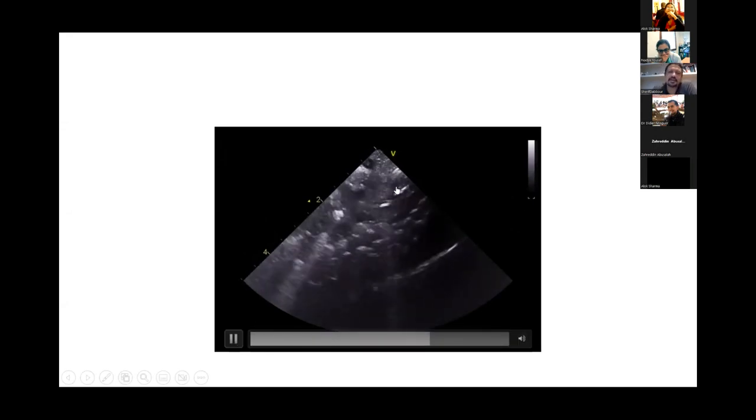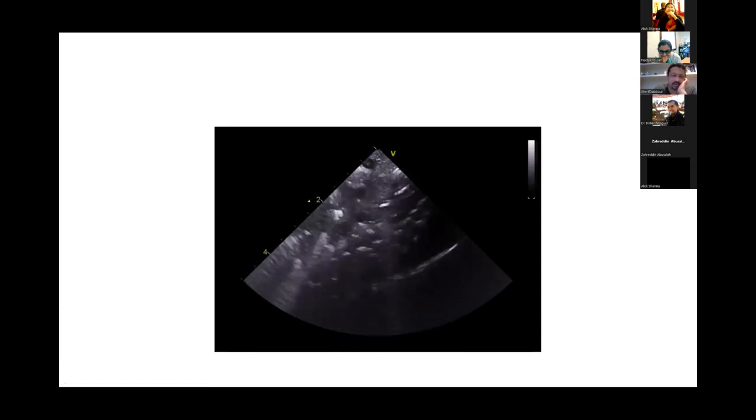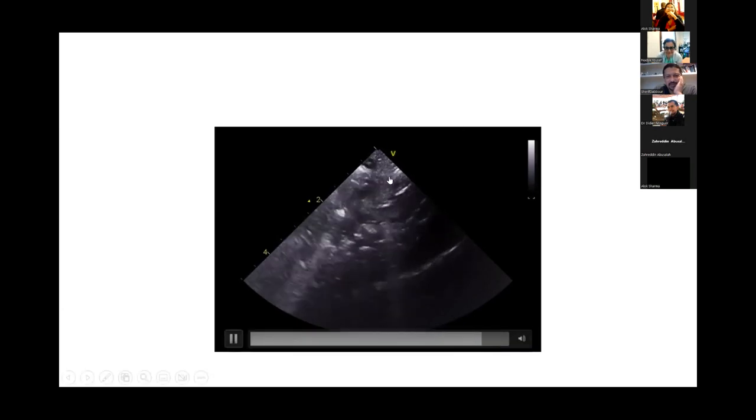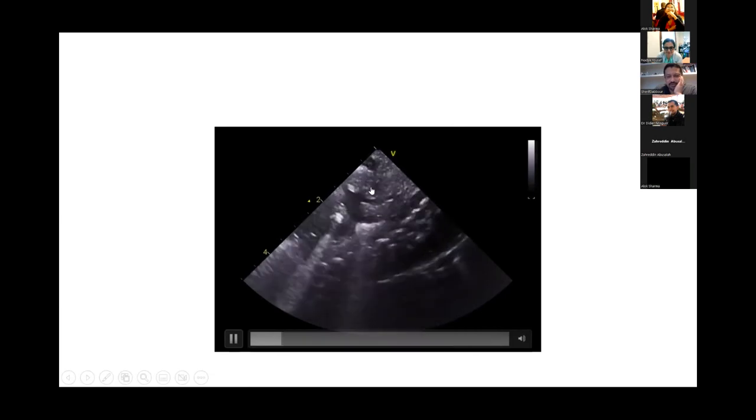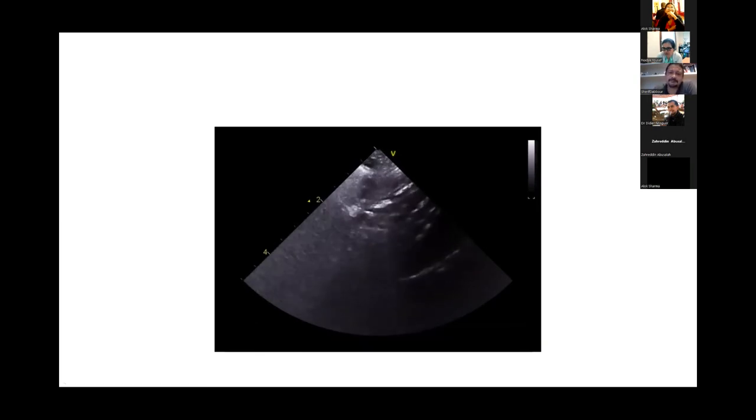I just tried in this video to visualize an ET tube, because I was told it was just pulled out. I couldn't use a linear probe because it was too big for the baby. So I used a cardiac probe, trying to get the aortic arch and see the ET tube, which I believe should ideally be 1 centimeter from the arch of the aorta. I could appreciate it on the top here. I tried to repeat it again, and I could see it here. Their air entry was equal clinically on both sides, so I presume this is in a good position. And you also had equal lung sliding on both sides, which could also help you. Yes, equal lung sliding, yeah.